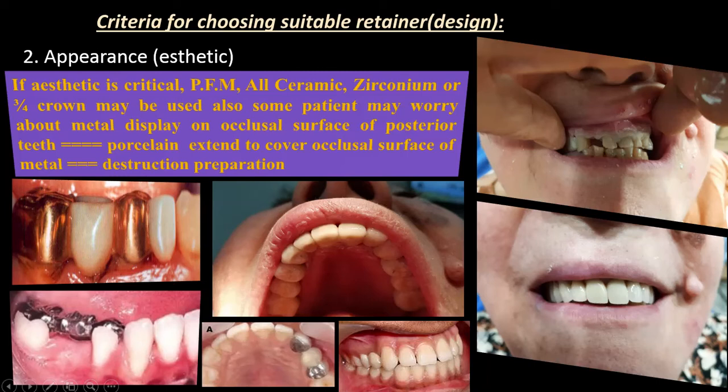زين فلذلك البورسلين أيضا ممكن المارجن ميتال مرات display metal on the occlusal surface of posterior teeth حتى نصير ممكن يعني ما نغطي كل الكراون بالسيراميك نقلل to conserve the tooth. لذلك لما نسوي ممكن هنا هذا bridge porcelain fused to metal cover all the occlusal ممكن لا it is not cover. مريض مرات يقول لك هذا يأثر على الاستاتيك، مريض يقول هذا يأثر على أريد النوع الآخر، مريض آخر لا يتقبل.